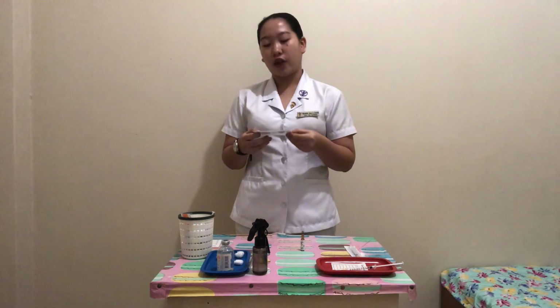Now it's time to break open the ampule. So take the clean gauze and wrap it around the head or neck of the ampule, and break it off the top by bending it away from the body and away from others.